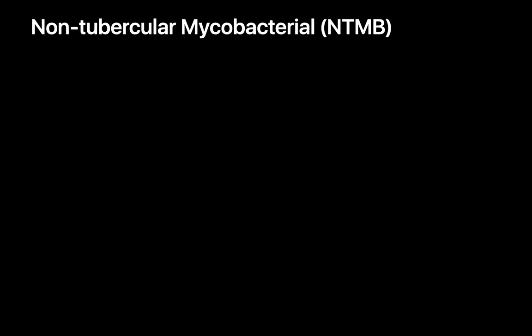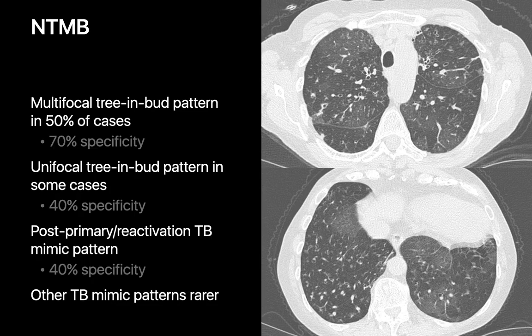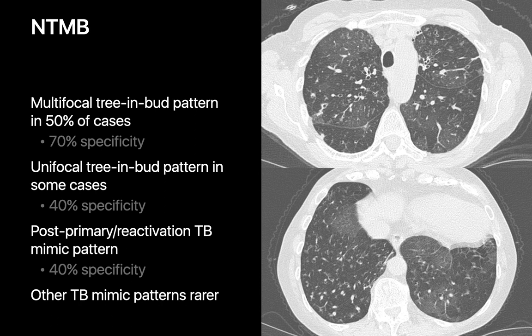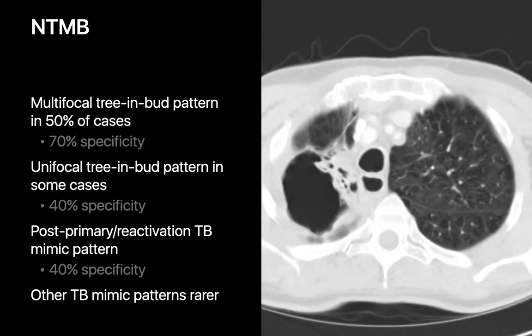Non-tubercular mycobacterial lung infections, such as MAI, classically present as a multifocal tree-in-bud pattern with associated bronchial wall thickening, bronchial dilation, and mosaic attenuation. However, they can sometimes present with these imaging features in a unifocal distribution. Non-tubercular mycobacterial infections are also referred to as TB mimickers, in that they can mimic the ways TB presents — for example, with a post-primary type appearance featuring a cavitary apical fibroproductive opacity. Miliary or random nodular interstitial patterns are also possible but much less common.